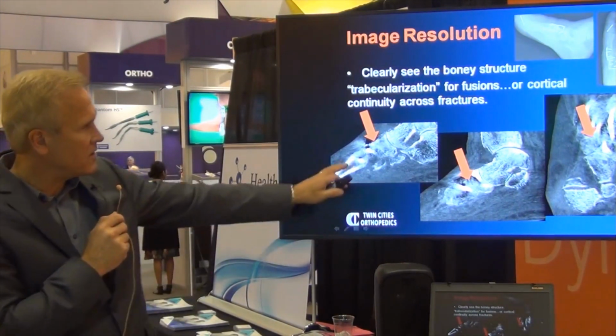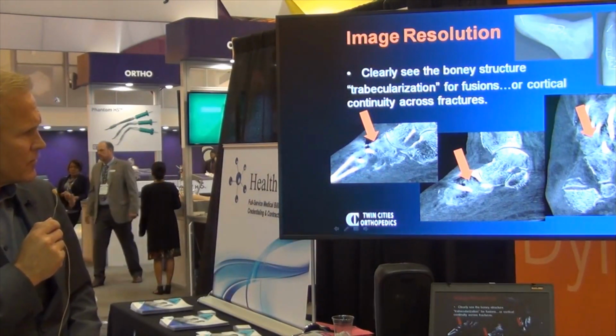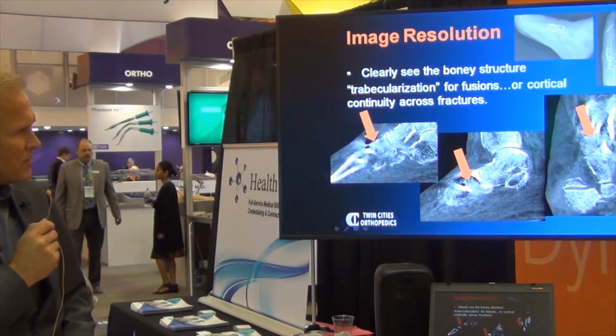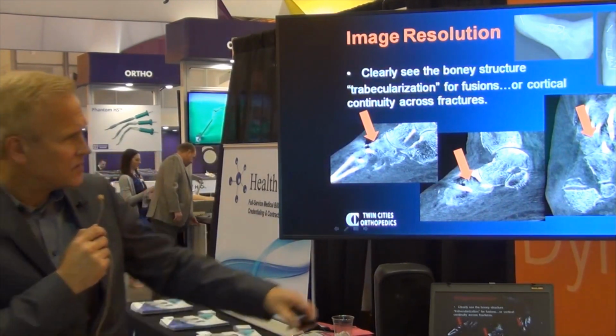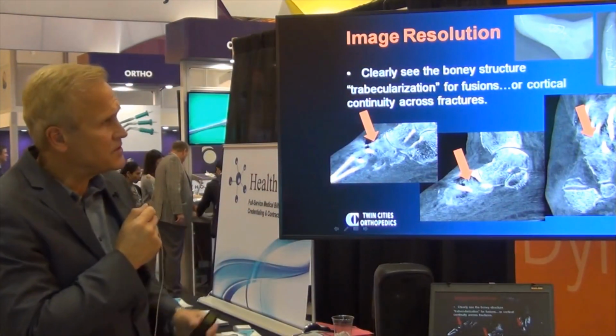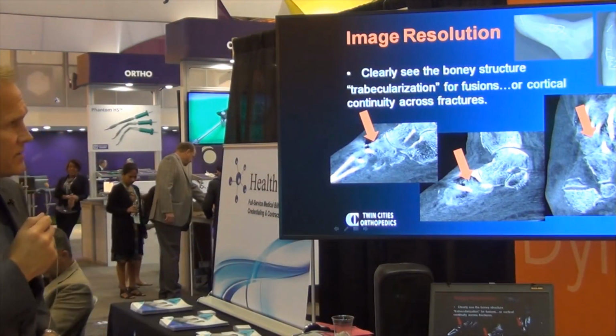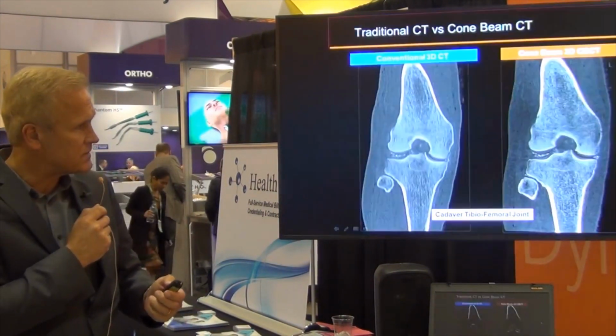So it really does help me look around the hardware. I can see the trabecular bone very well. So it just gives me that valuable information. And this is the frontal view. The resolution's high enough that I can clearly see there's a good connection between the two fusion surfaces.